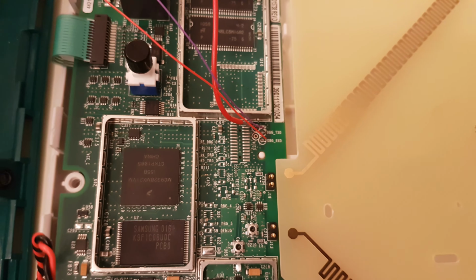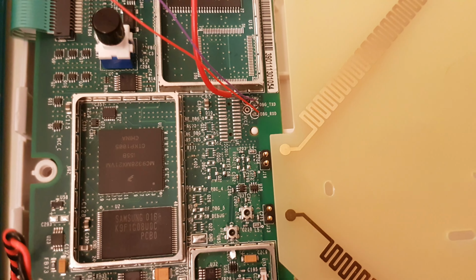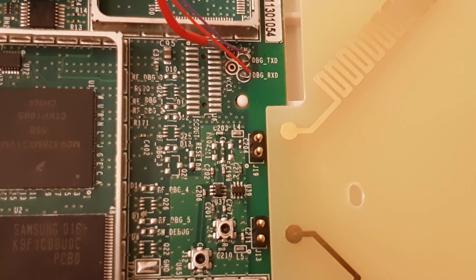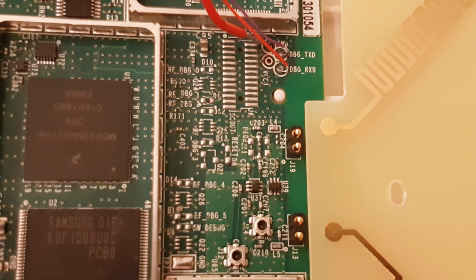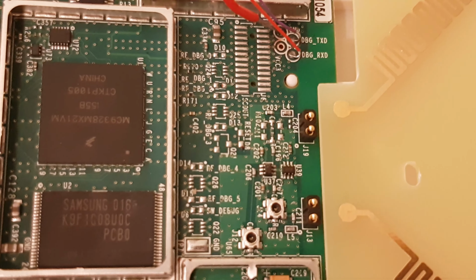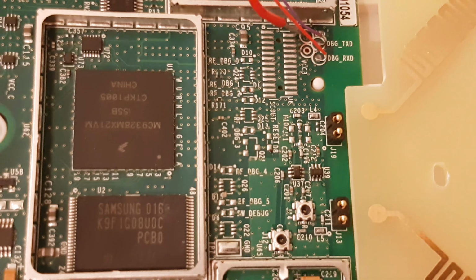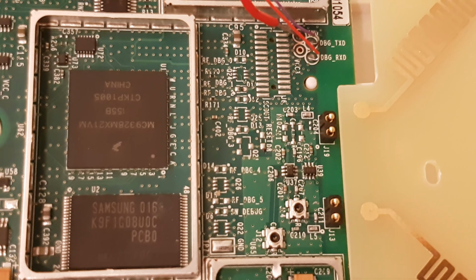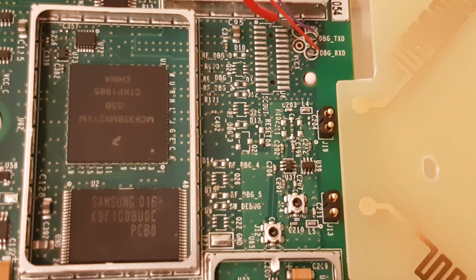Oh, I guess I should talk about the wires that are sticking out of the side here. So I actually soldered onto this debug, transmit, and receive. And up at the top left-hand corner, there is a ground, and that's a UART. So that's a UART console, and it allowed me to actually log into the device eventually. So if there's any interest, I'll post a video on how I actually logged into this device using single user mode and interrupting the bootloader.